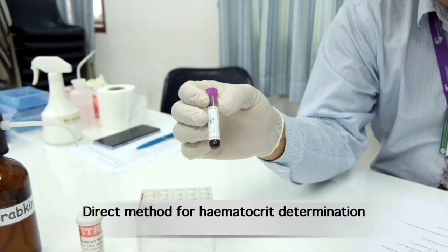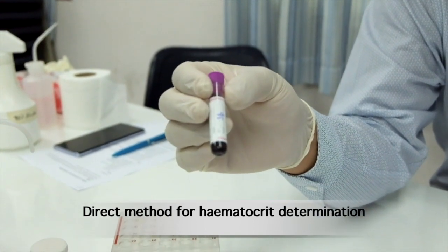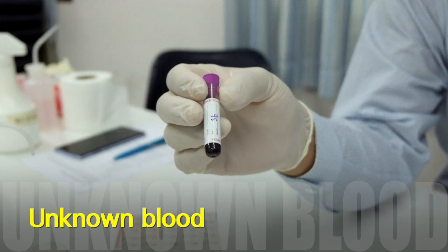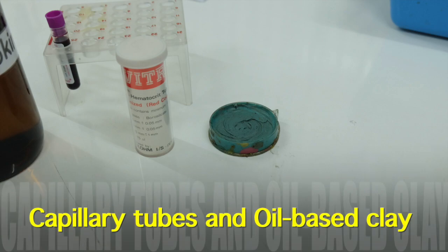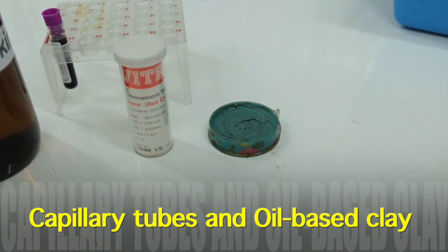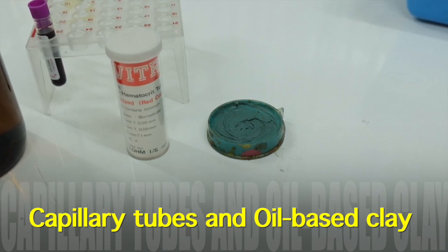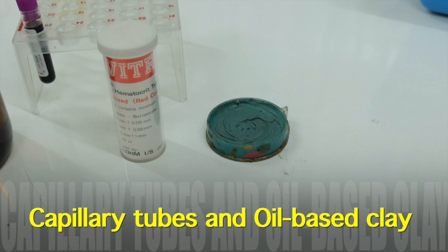Direct method for hematocrit determination. In order to determine hematocrit by a direct method, you receive an unknown blood in a collection tube coated with anticoagulation agents from the hospital, a pair of capillary tubes, and an oil-based clay in a flat tub.